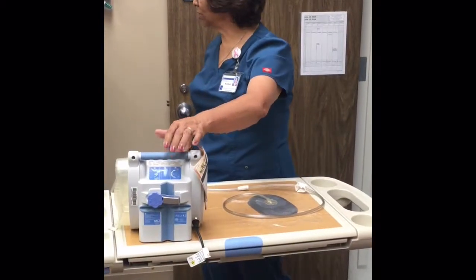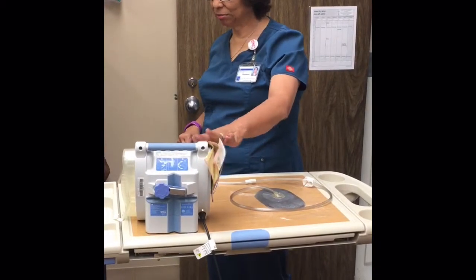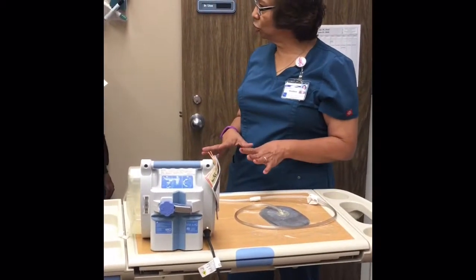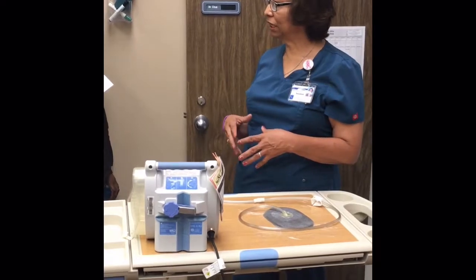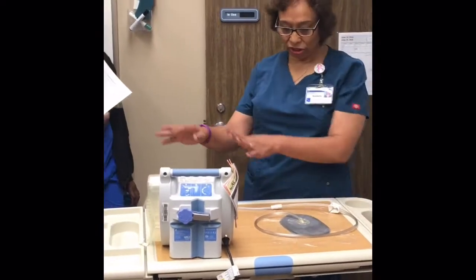You have lots of patients that come in through this unit with a VAC system. This VAC system is for deep wounds with lots of drainage, things that we need to control, and so it's a negative pressure dressing. It will come with the patient just like so.